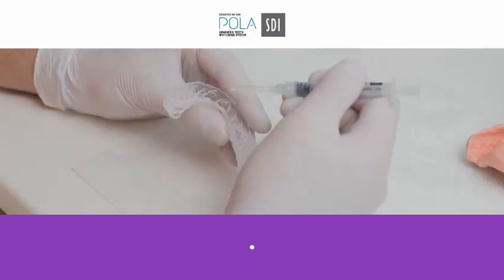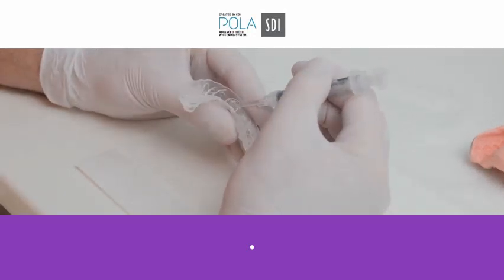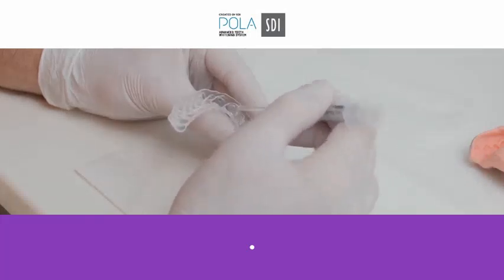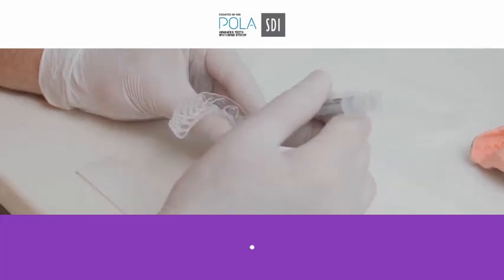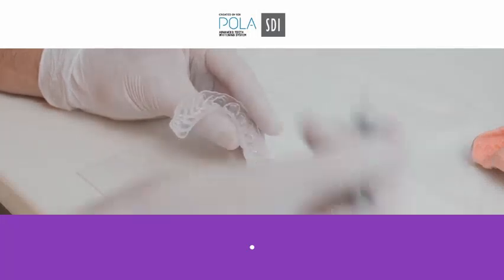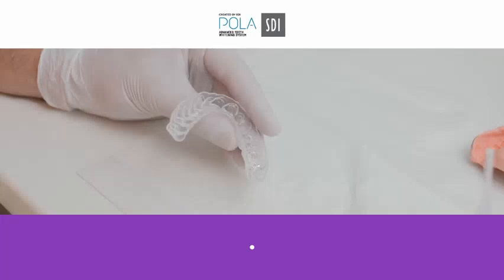What I always say to my patients is all they realistically need to do is put a small blob in each area. I'll do this with another syringe in a second, but just a small blob in each of the areas, about 2 mils. And that will be enough for the 45 minutes to an hour of whatever you're doing.